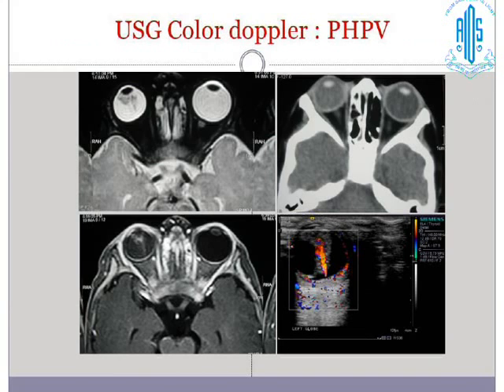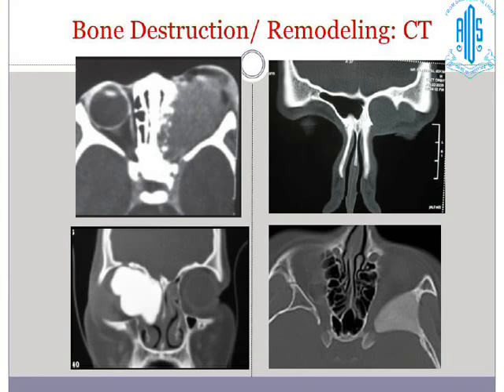Okay, another patient, a child with a white reflex who was not easily diagnosed, suspected to be a retinoblastoma, but not quite sure. T2 weighted images do show what looks like a tumor behind the lens. On T1 post contrast, there is a mild thickening and slight contrast enhancement. We were still not sure. CT did not show any calcification, still at a loss. Ultrasound does show an embryonic vascular channel, which is almost a giveaway, a diagnosis of persistent primary hyperplastic vitreous.